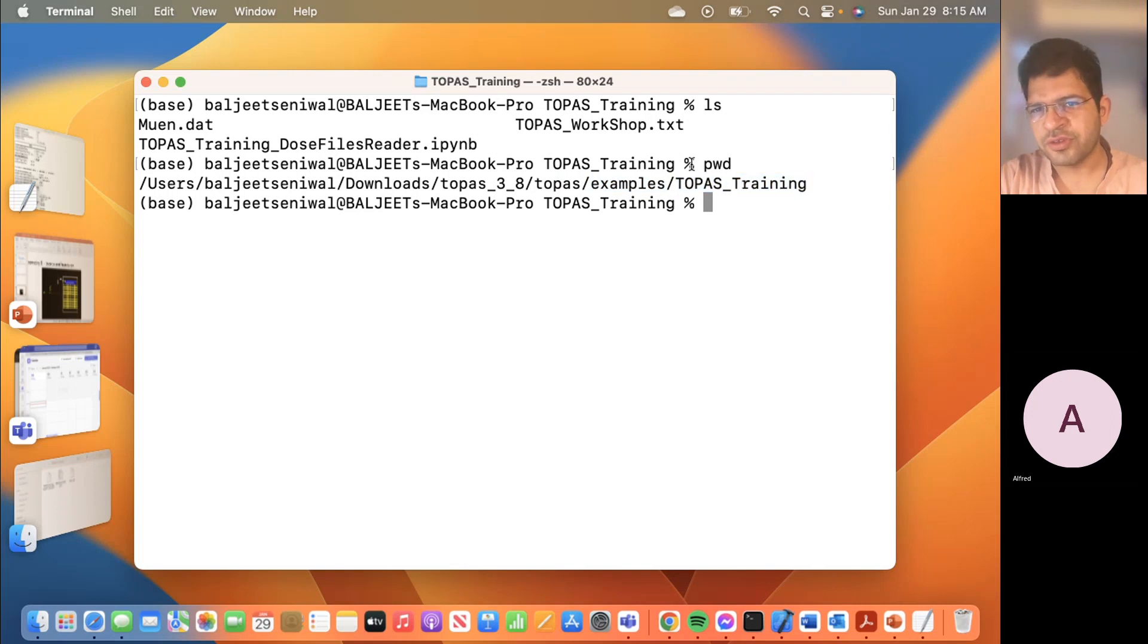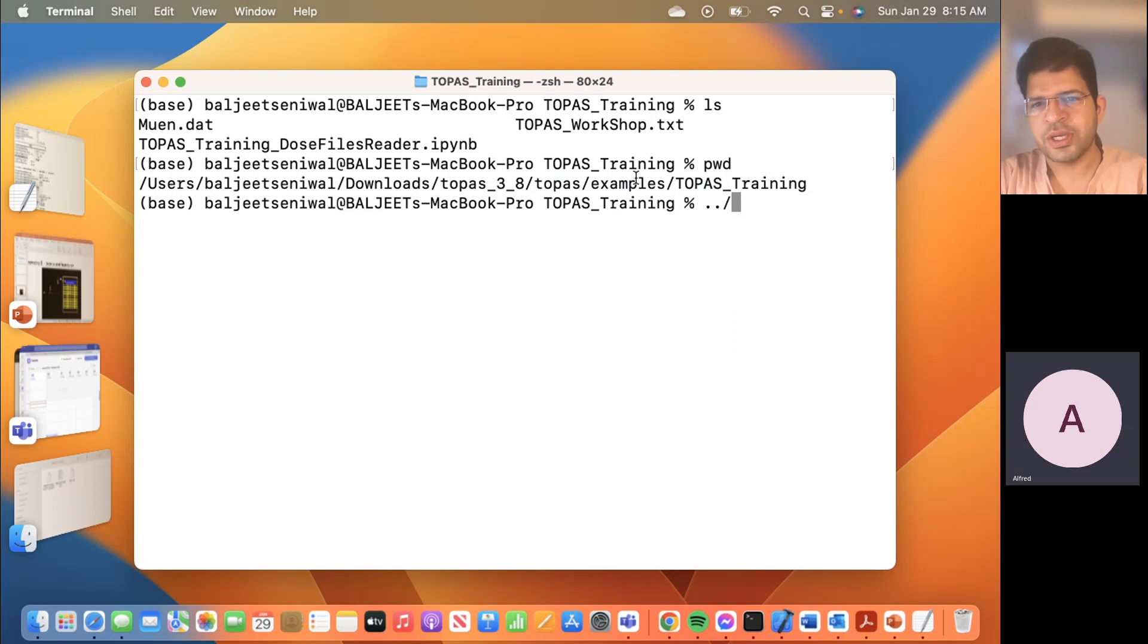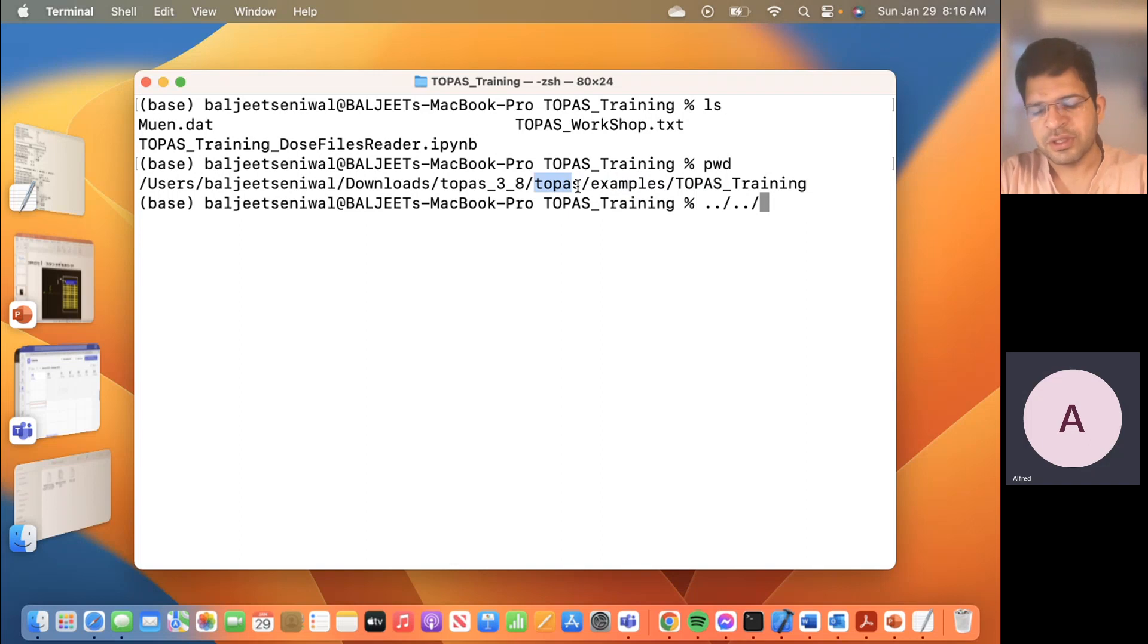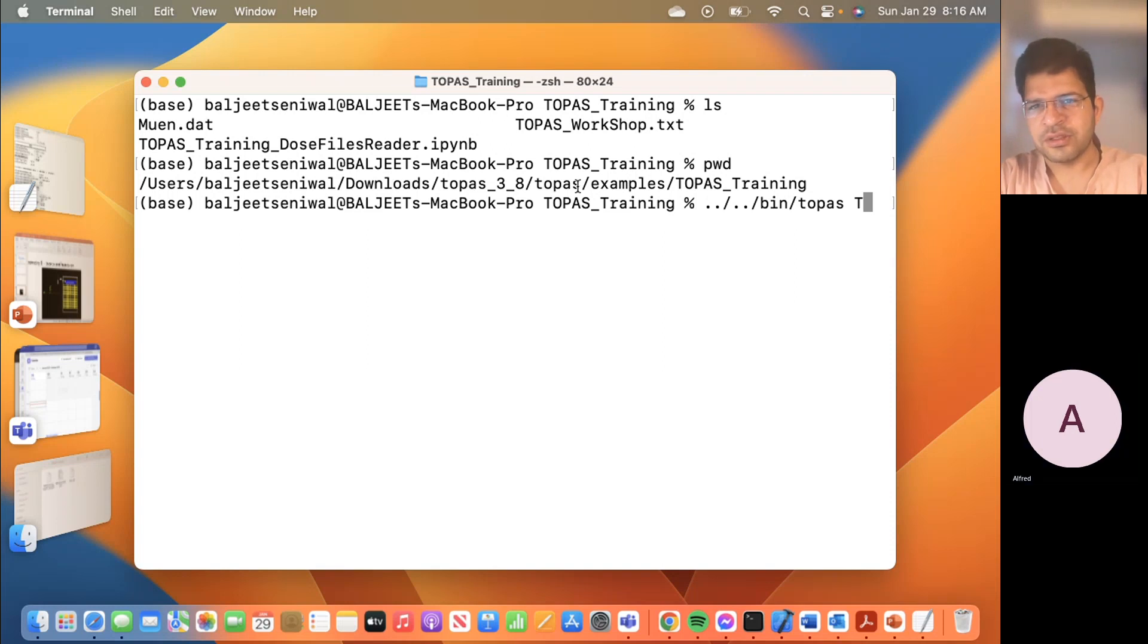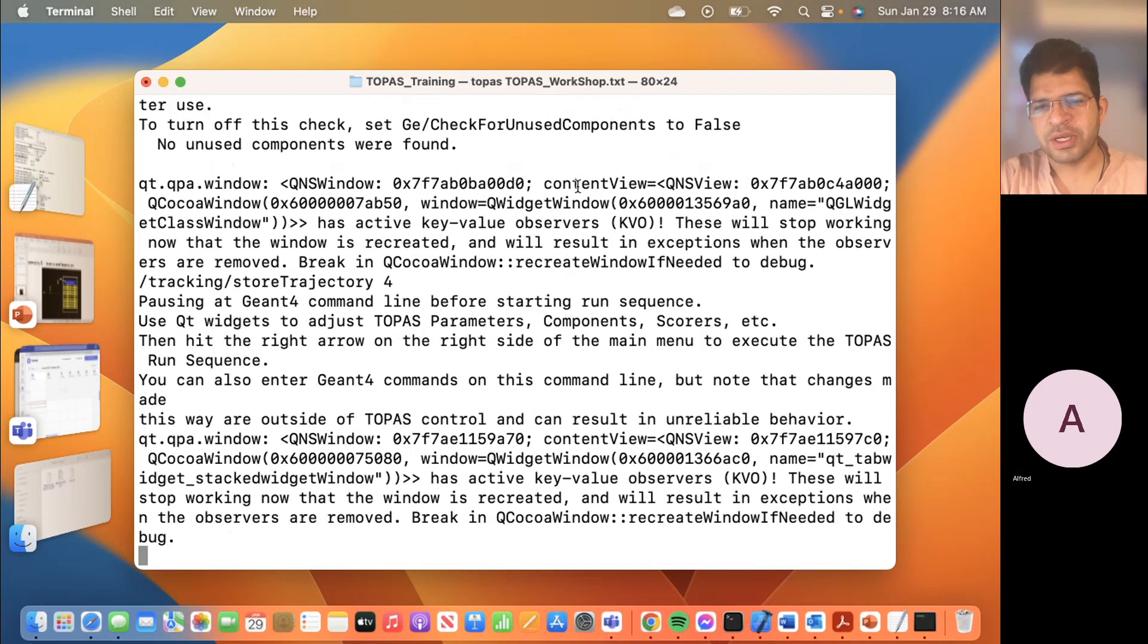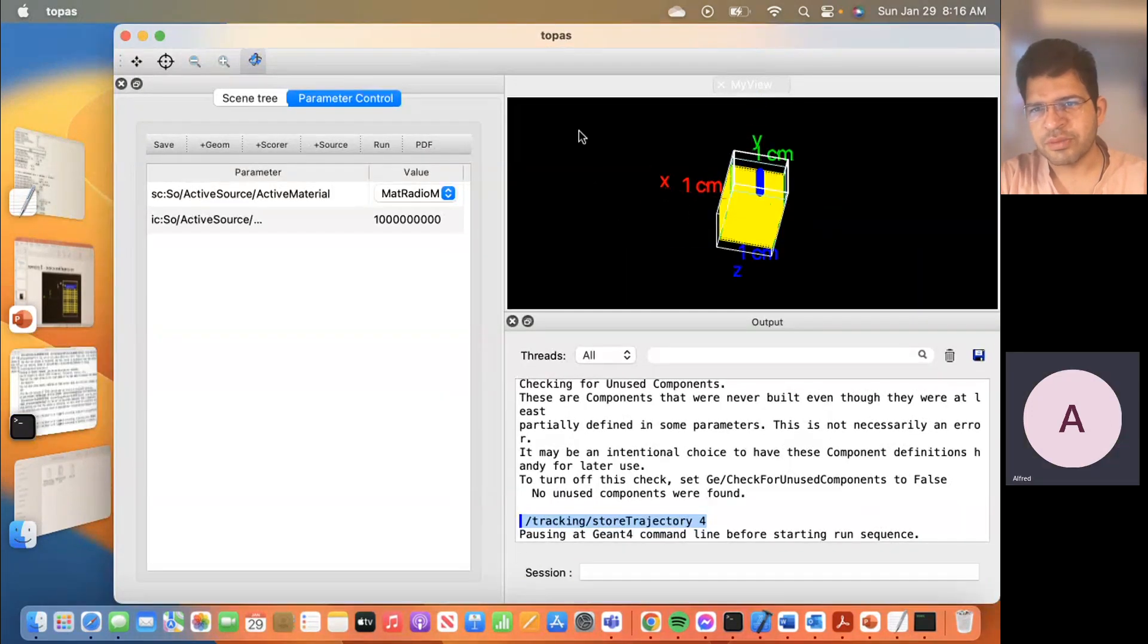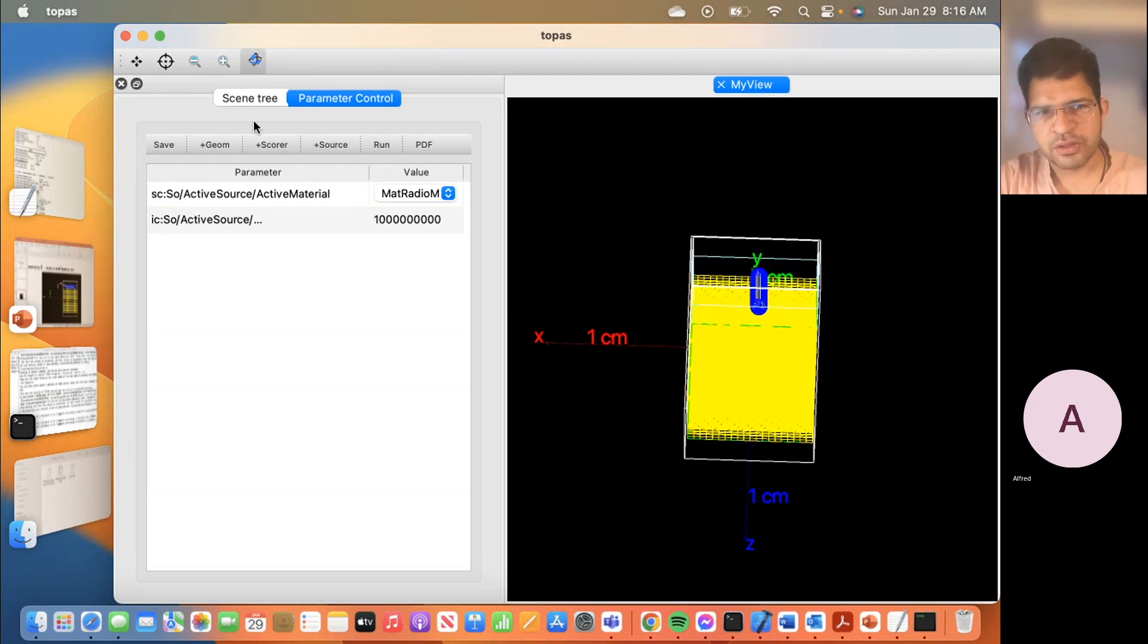By this command you step down a folder down. So you are moving from TOPAS training to examples. Now you are in examples. So we want one step down more. Like I said, in TOPAS there is a bin directory inside which there is the executable of TOPAS. So we go into bin and we execute TOPAS. This is how you run your TOPAS example. And then you run TOPAS workshop txt. So it will start running TOPAS on your system. And you see, this is the exact simulation geometry that I was telling you. And here when you see, these are the control parameters. I've set like how many photons you want to run. I have set to 1 billion, but for initial we won't need 1 billion.